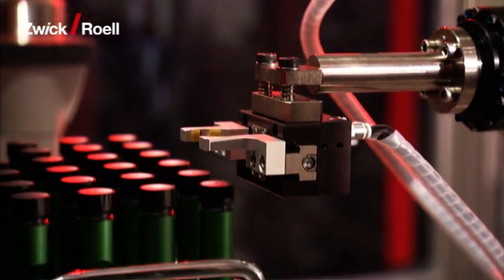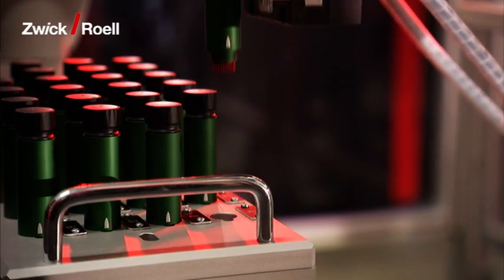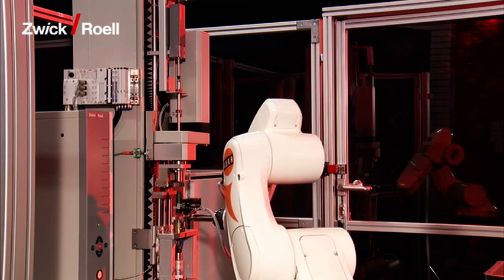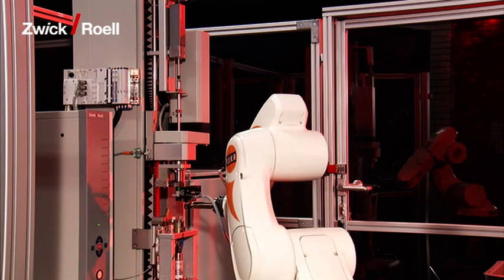The robot extracts the first specimen from the magazine and positions it directly in the test device mounted in the machine.